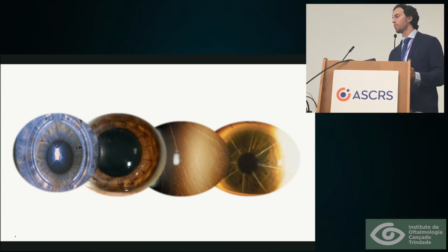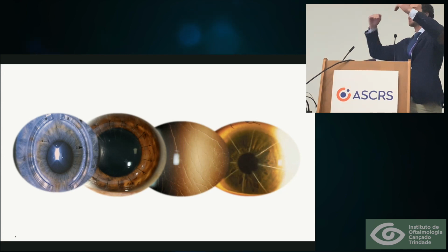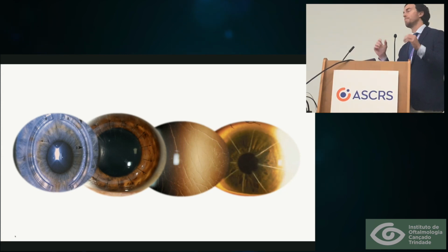I couldn't agree more with everything that you said, and I learned a lot from your talk. And in our experience, the best patients of all so far have been the ones that have RKs, because they have a double effect. Most of the time RK has some irregular astigmatism, and at the same time they block this photopsia created by the incisions.